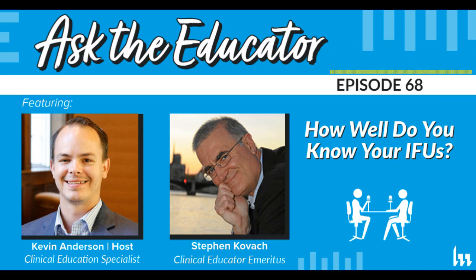Yeah. I hate to bring this back around to something else, is we see it with the shavers, what, 10, 11 years now, been an issue, maybe longer than that. Some people buy a borescope or flexible inspection scope. They don't use it. We still see many departments that don't have it. And not all the IFUs are the same. And I'm going to address that a little later. But if your standard of care is you should be looking at them, you should be, to reduce the chance of having that problem. And that gets back to me is, how do you define the word inspect?